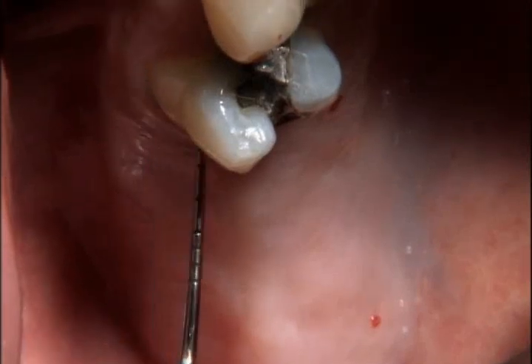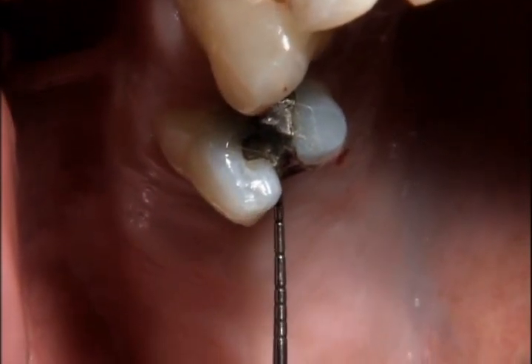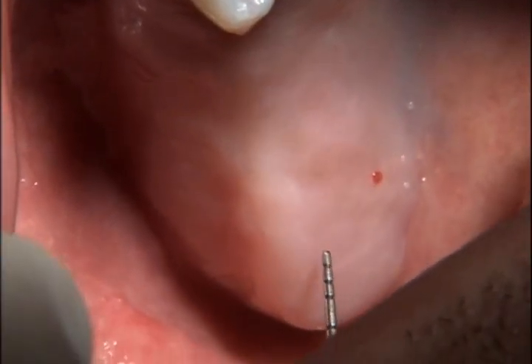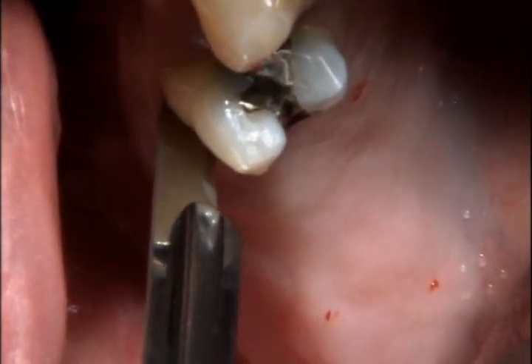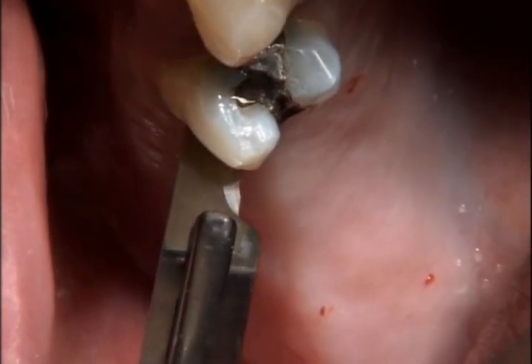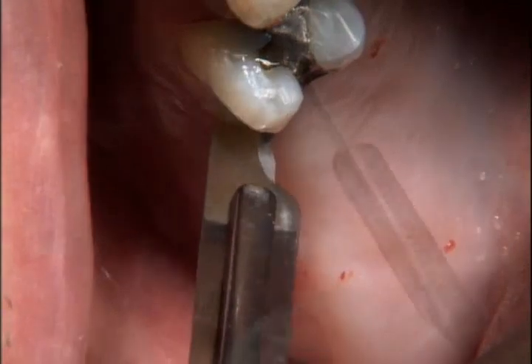The flap was designed with a palatal paracrestal incision extending distally from the distal palatal aspect of the first premolar tooth. A buccal intrasulcular incision about this same tooth was used to avoid a vertical releasing incision anteriorly.